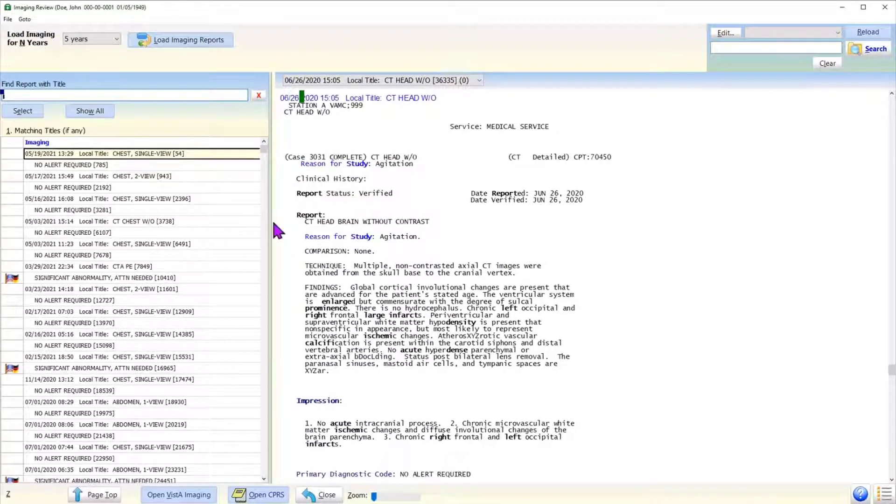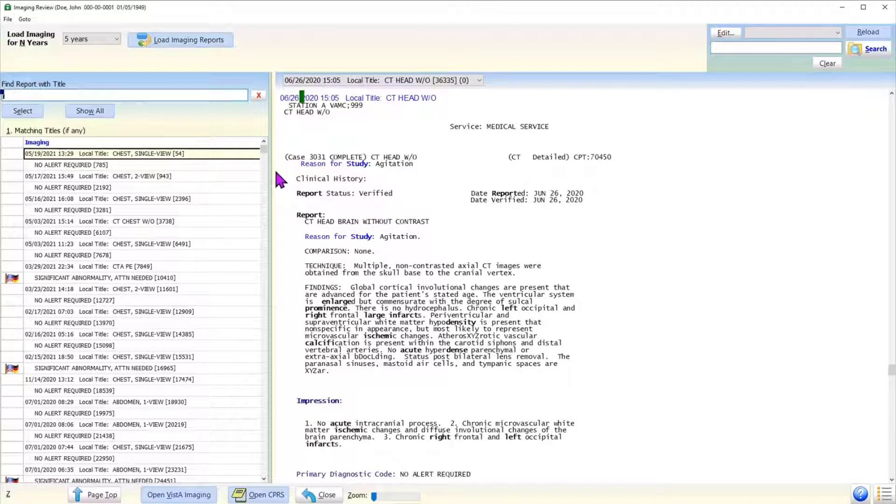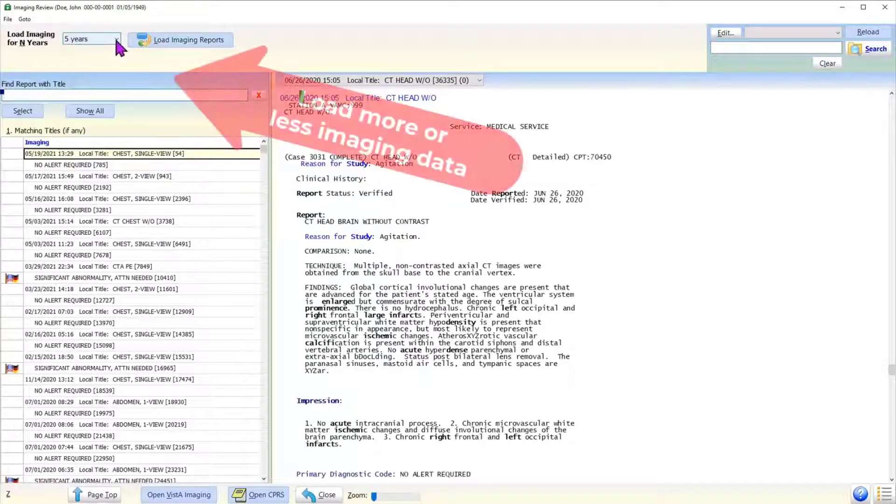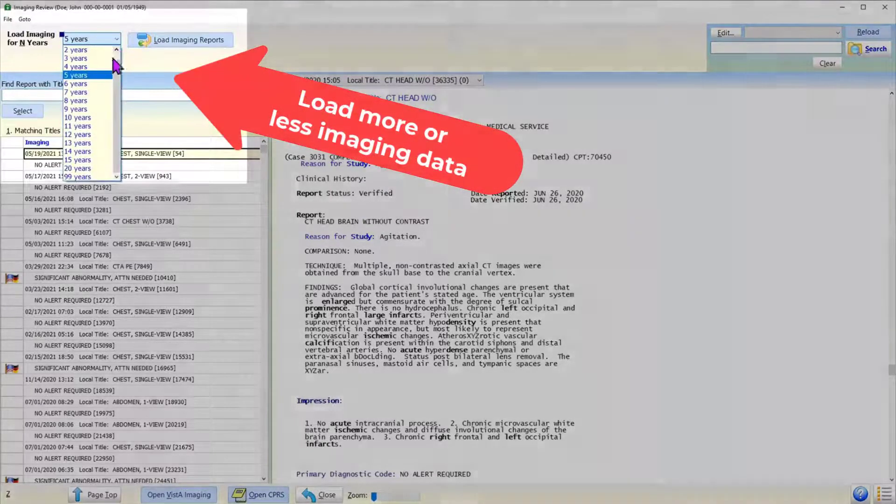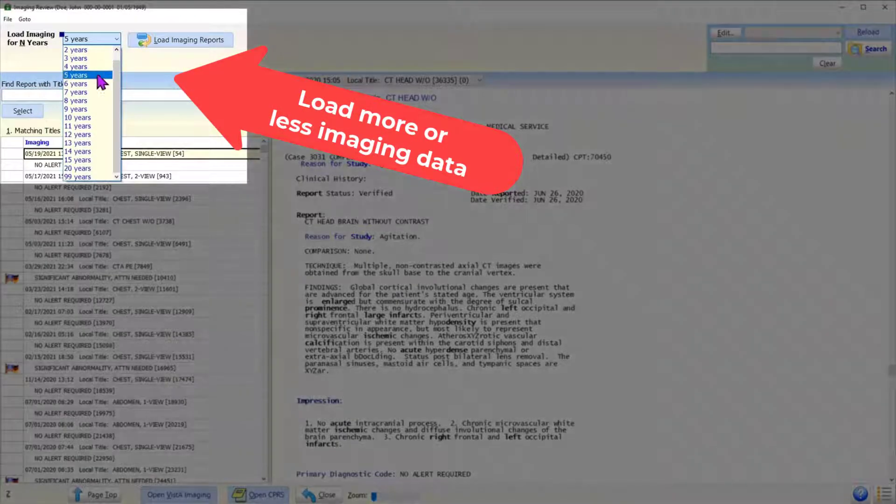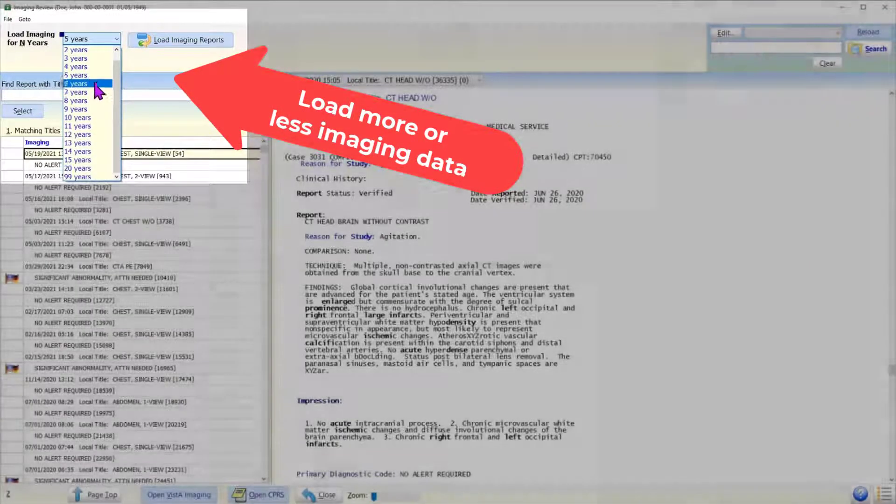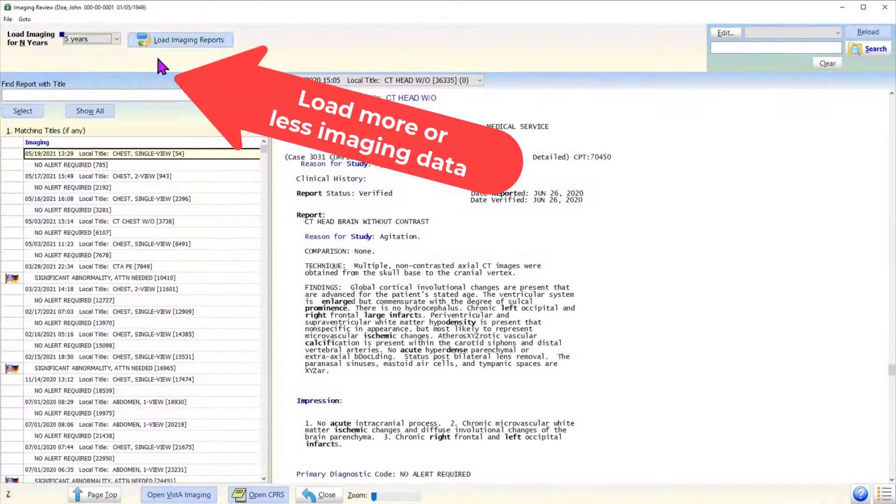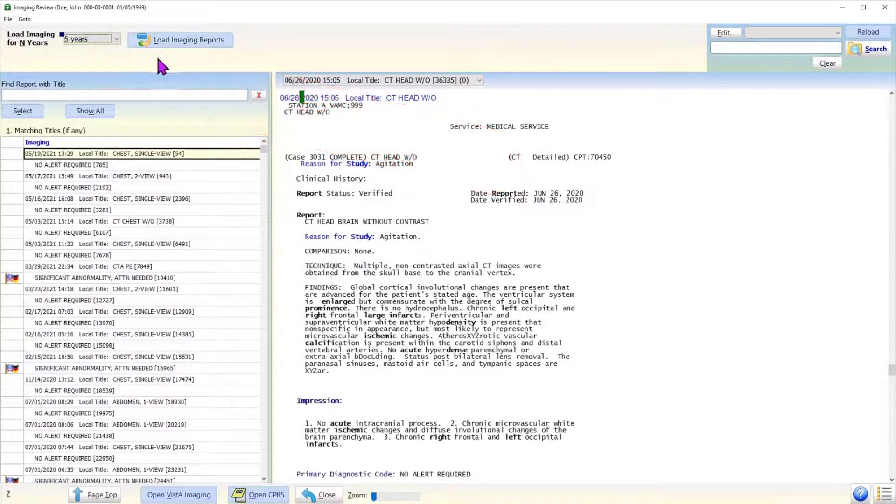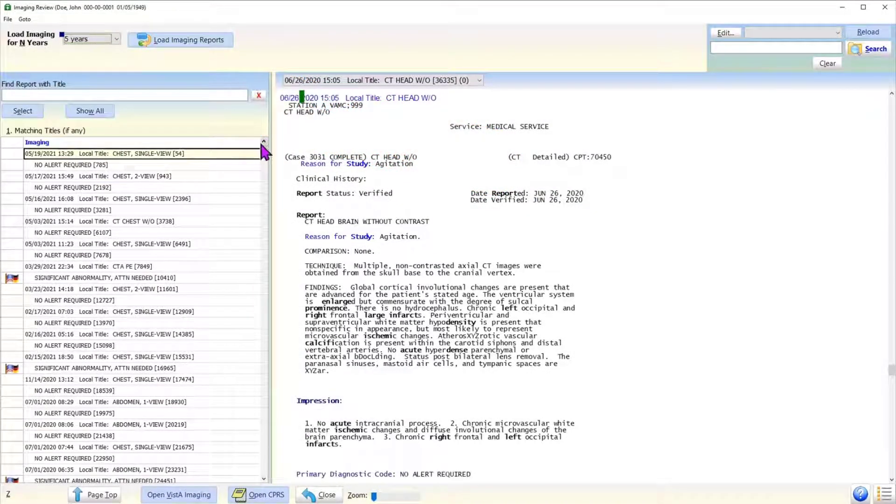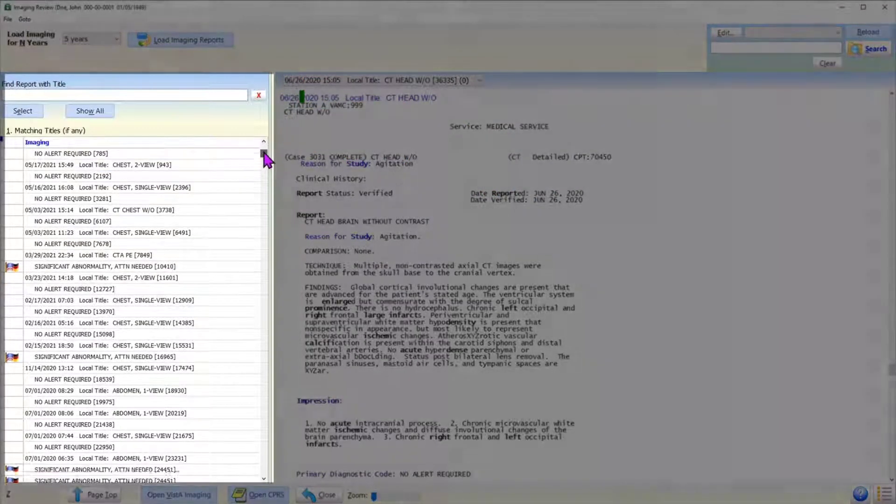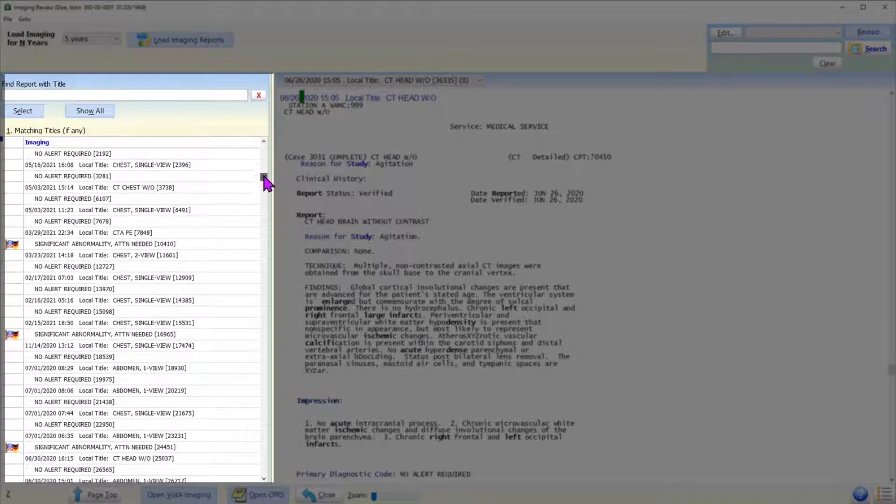Let us take a look at the user interface. On the top panel, the user can load the imaging reports for a different date range. The imaging review form shows the list of imaging reports along left side of the form.